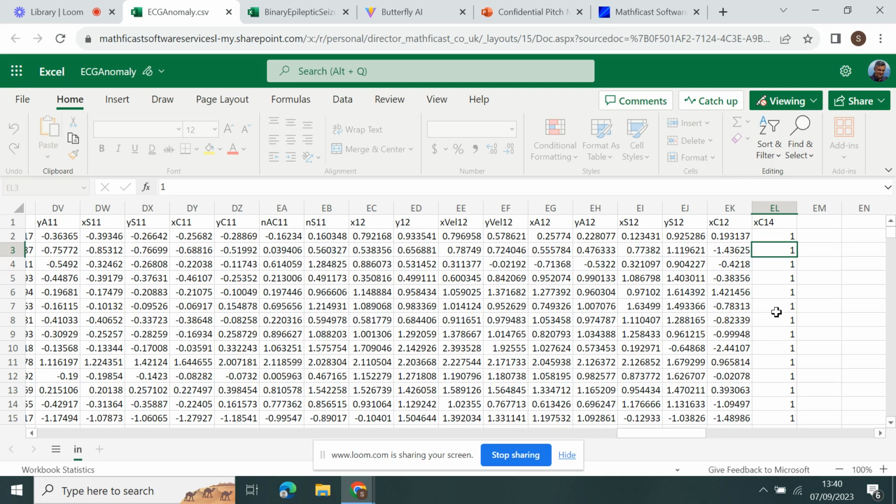This data was labeled by human experts, medics, and those are the HCPs that, by analyzing this data, have scored some problematic ECG with some anomalies. Now, the idea is to let Butterfly AI train itself and learn from this, and then to assist human HCPs and medical experts to come up with a secondary decision in terms of detecting these anomalies. When we detect these anomalies within ECG signals, we can identify that there may be an underlying health problem with this specific patient.